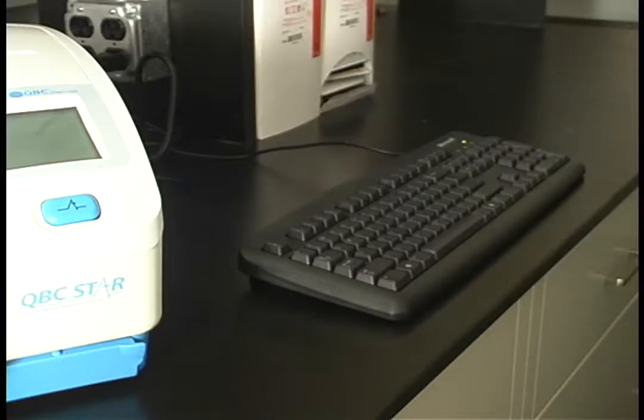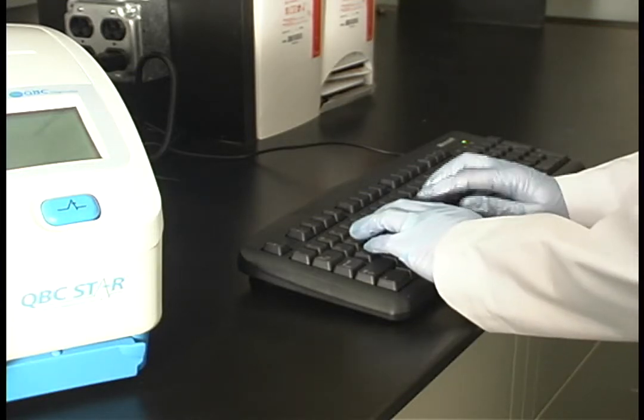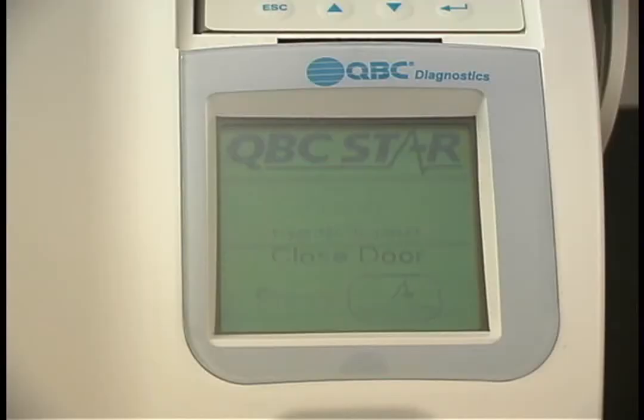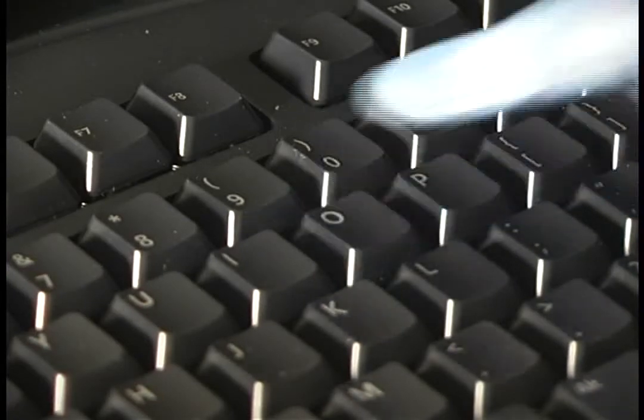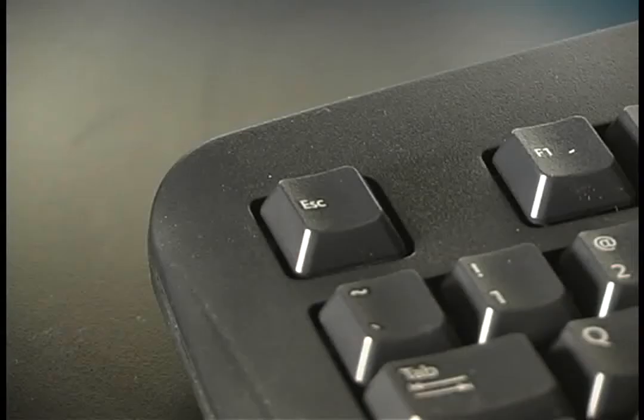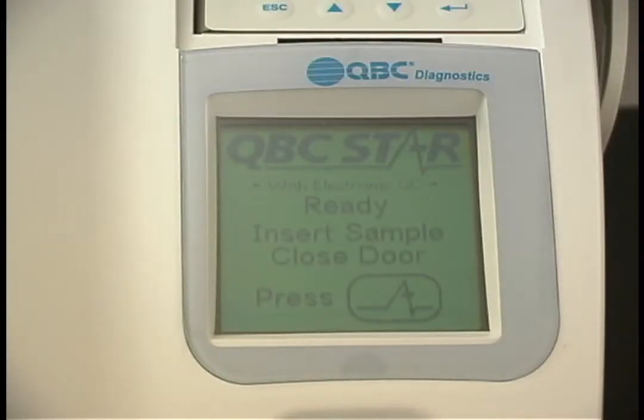If you are entering an operator ID or a sample ID, such as a patient name or birth date, begin typing the information on the keyboard. After pressing Enter, your screen will prompt you to select sample or operator ID. Press S for sample ID or O for operator ID. If at any time you would like to exit this menu, press the Escape key. The star will then return to the ready screen.